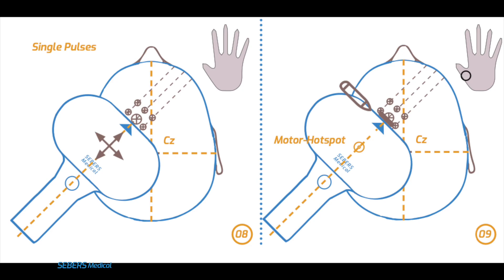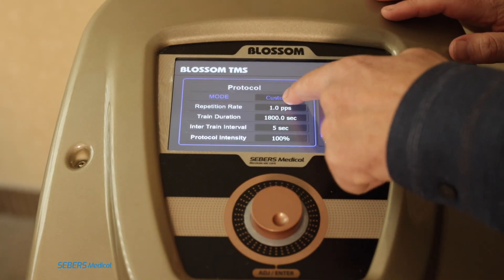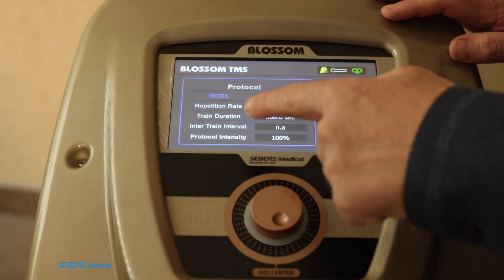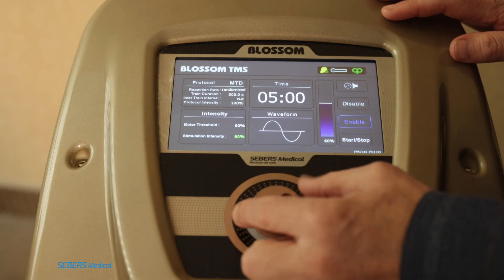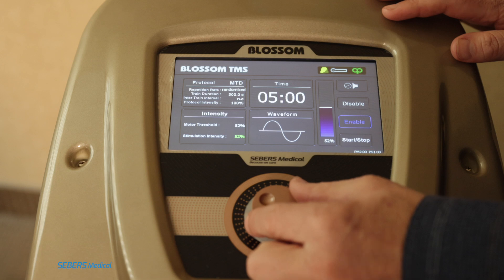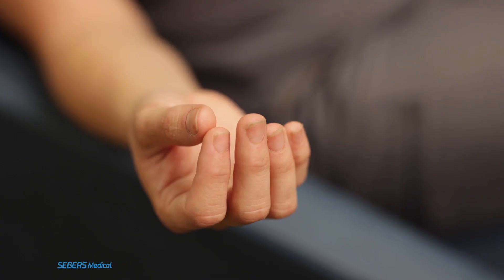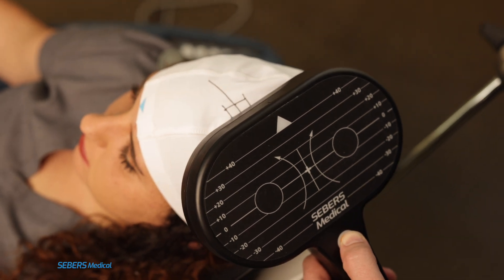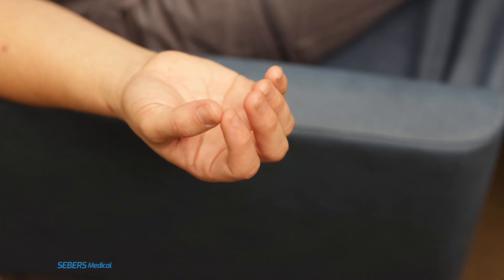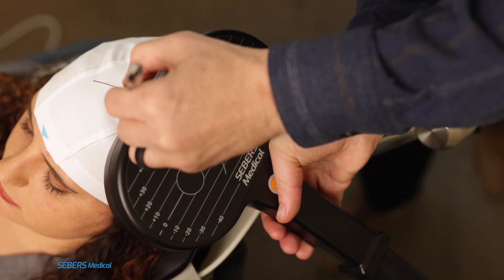Now we're ready to begin delivering single pulses. Set the device to the MTD protocol and start at 50% intensity. Make sure the patient's right arm is relaxed with their thumb and index finger gently touching. Deliver pulses within the newly marked nine-point grid and watch closely for small twitches in the thumb or index finger. Once you see a consistent twitch, you've located the motor hotspot. Mark that spot clearly.